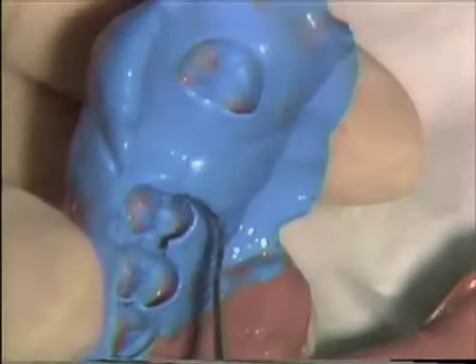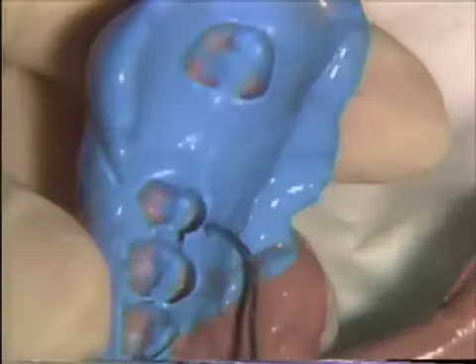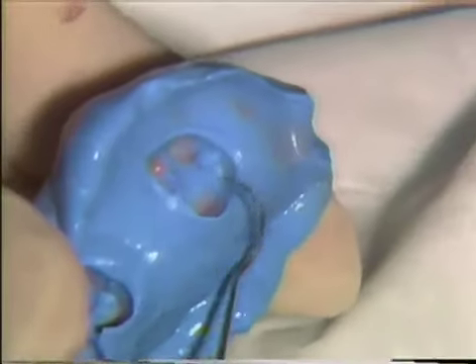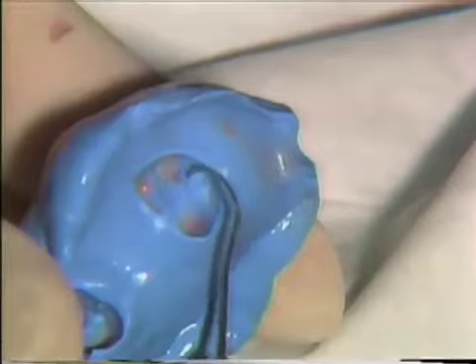I'd like to show you the features of the impression we've recorded. The groove. We've checked the margins all the way around. We have the occlusal rests. You can see the mesial groove and the margin, and on the distal, the finishing line as we go on to the occlusal rest.